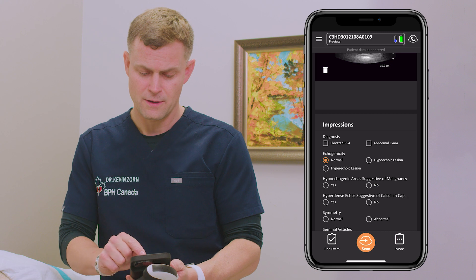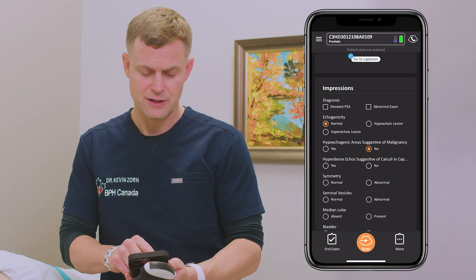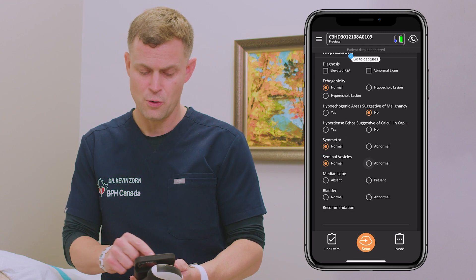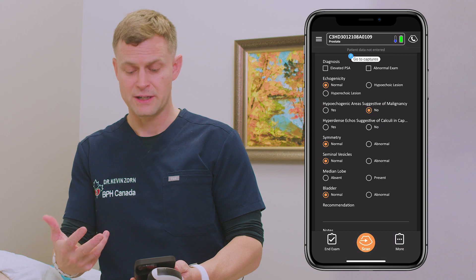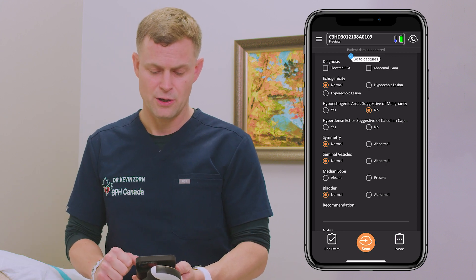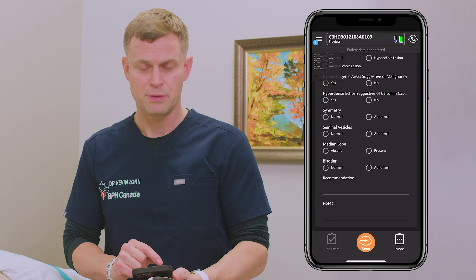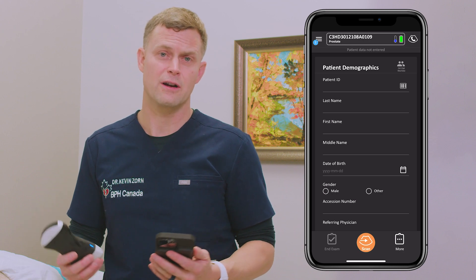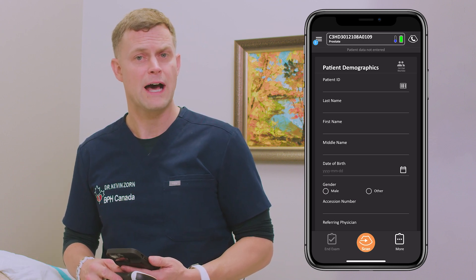We can see it was normal — no hypoechoic or calcification areas, it was symmetric, the seminal vesicles were normal as we saw, there was no median lobe, and the bladder was likewise normal. At that point I can either use Siri dictation or type in my recommendations and notes. Once complete, it's sent to the cloud for implementation into the patient's chart or to the referring physician. That completes our Clarius C3 evaluation of the prostate and bladder for this gentleman.